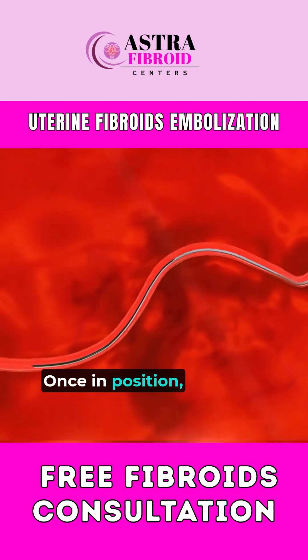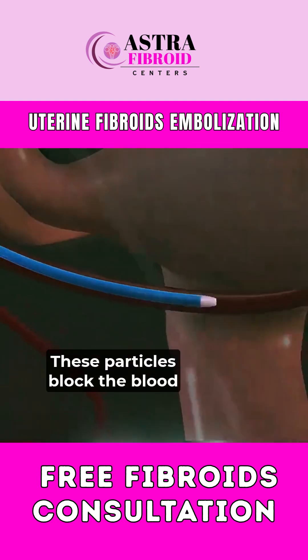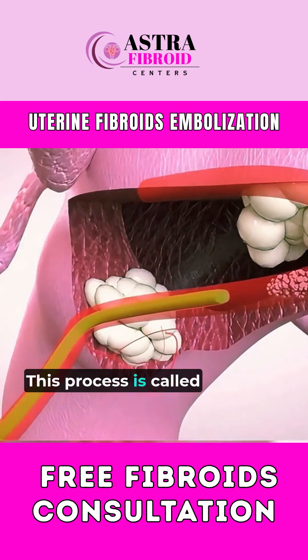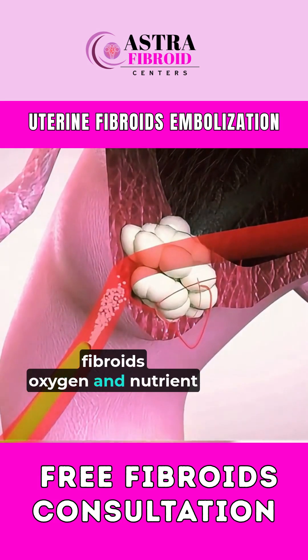Once in position, tiny medical particles are injected through the catheter. These particles block the blood flow to the fibroids, causing them to shrink over time. This process is called embolization, and it works by cutting off the fibroid's oxygen and nutrient supply.